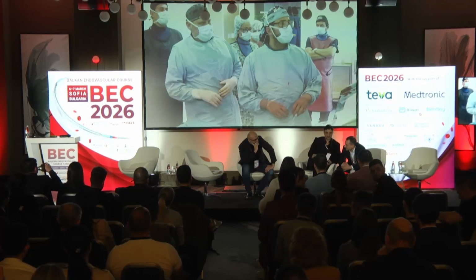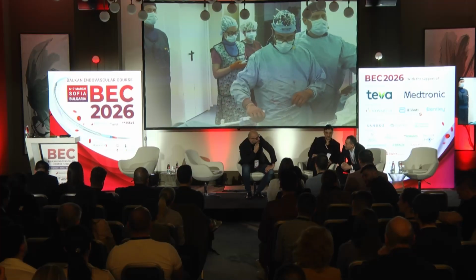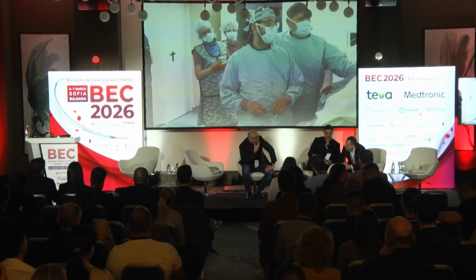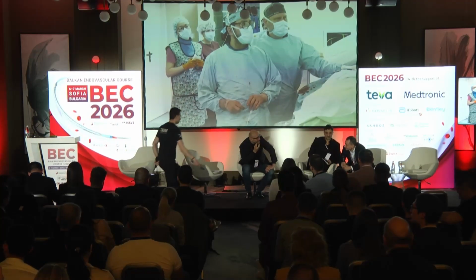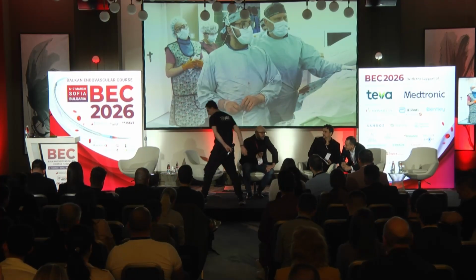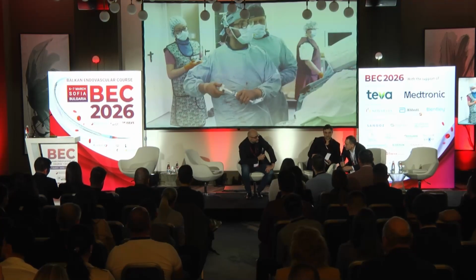It's better, of course. In some cases, I haven't used Zilver. Also some Optimed stents. Optimed is very good for radial force, but it's a question of money.